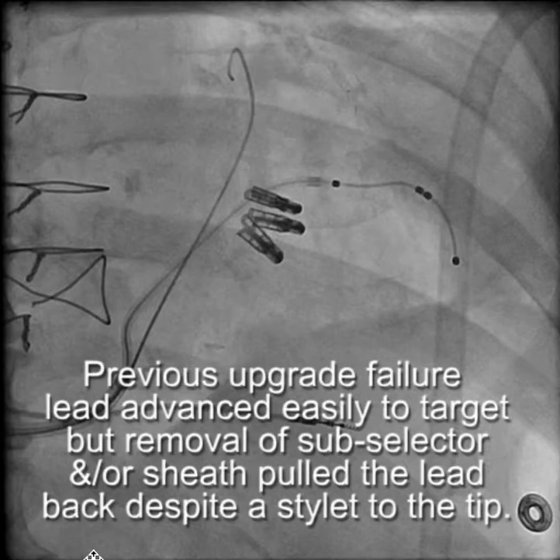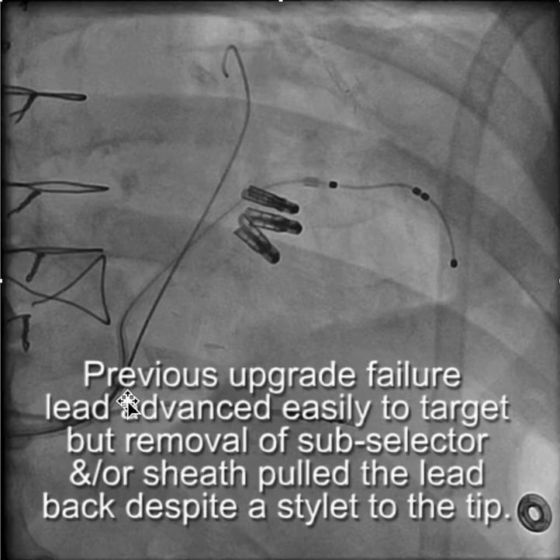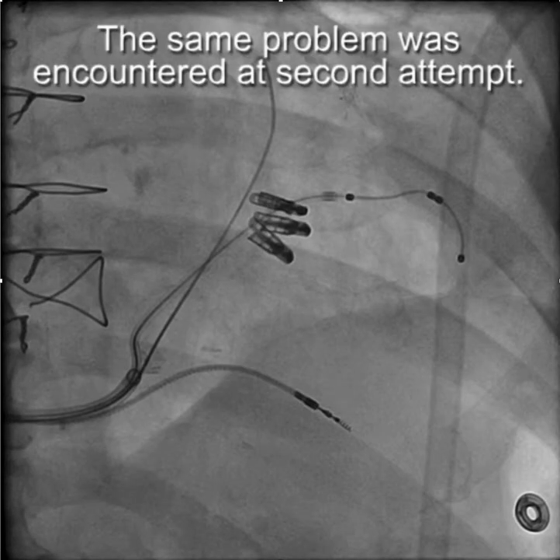This case describes the use of an Amplatz buddy wire in the subclavian vein in addition to venoplasty because of difficult venous access. There was a previous upgrade failure with a chronic RV lead — you could easily get the lead into the branch, but whenever you removed the subselector or sheath it pulled the lead back, despite putting a stilet to the tip.